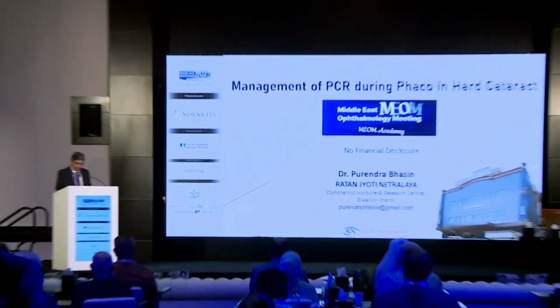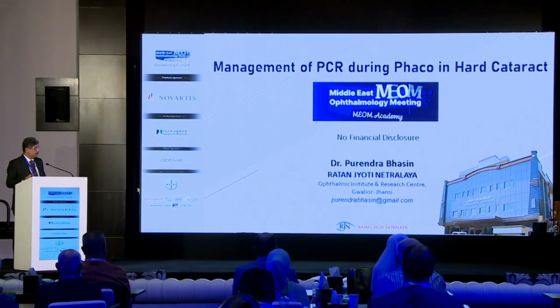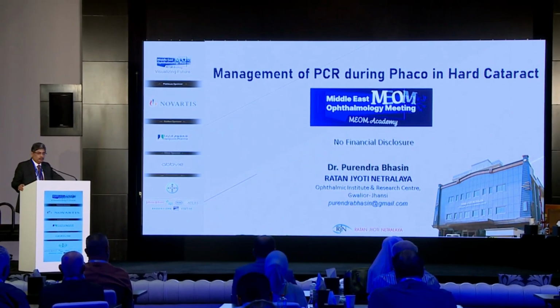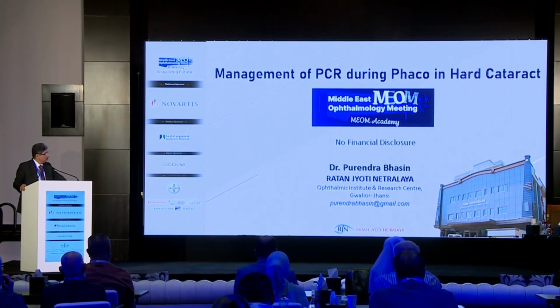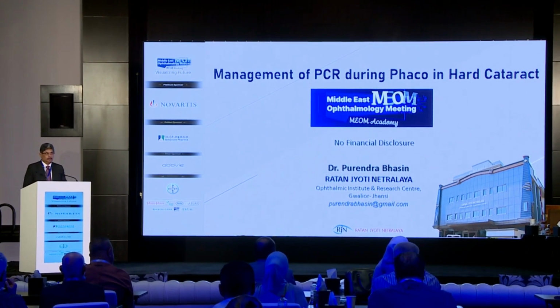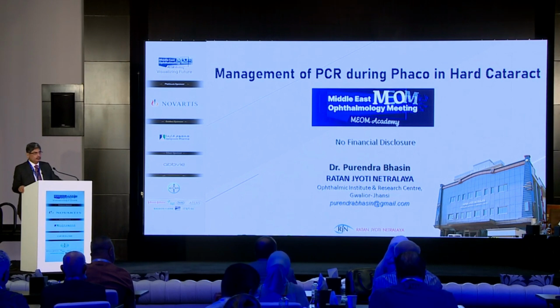When you have holes inside the nucleus, you crack the nucleus through the holes? No, you engage alongside the hole. Okay. And crack through the hole. You don't engage into the hole, you engage with the probe. This is your hand fixing the lens. The wall of the hole. And the weakest part is the hole.